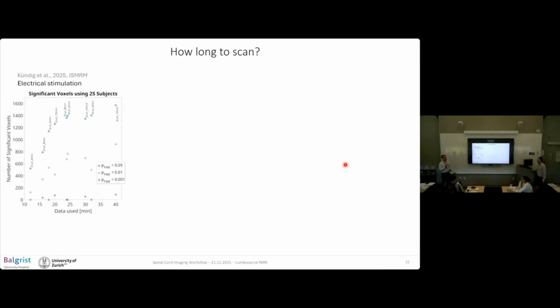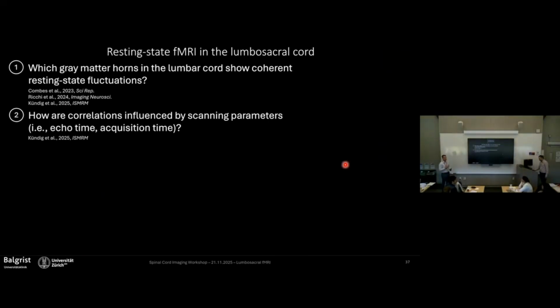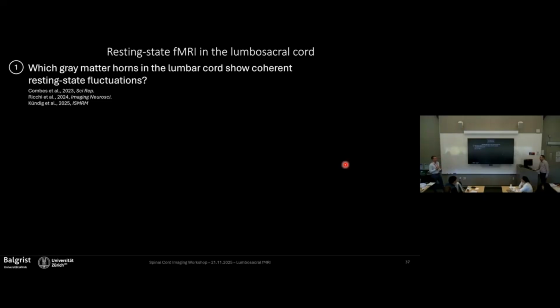Curious about patient size, and do you have any limits on the size of patients? Just because I assume, depending on how much subcutaneous fat they may have, that they're going to be much farther away from the spine coils. Yes. We definitely noticed that the further away we are from the spine coil, the worse the quality gets in terms of TSNR.